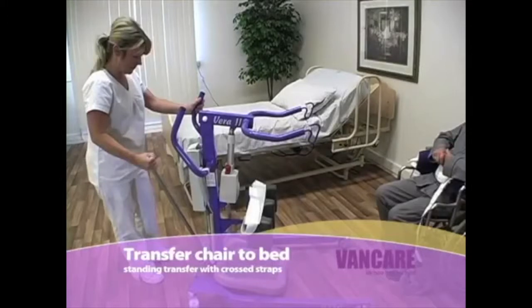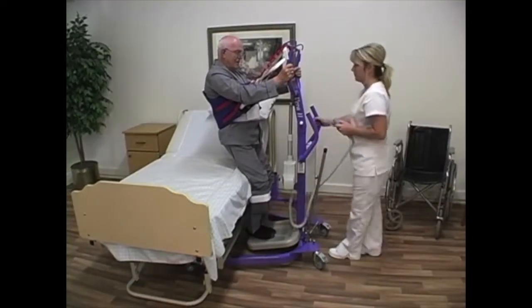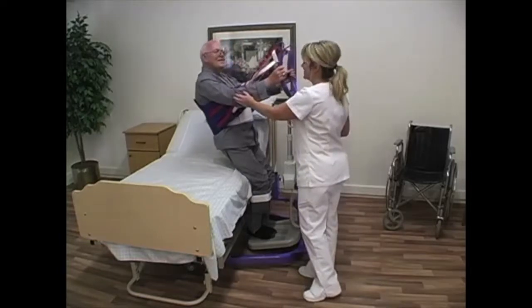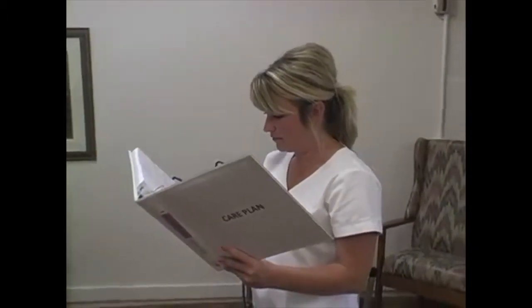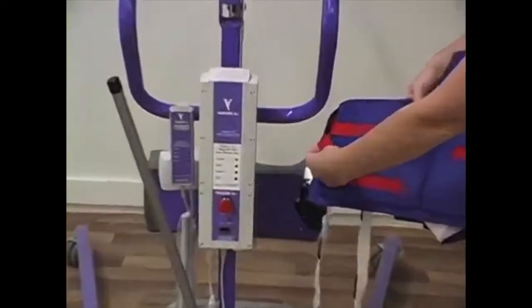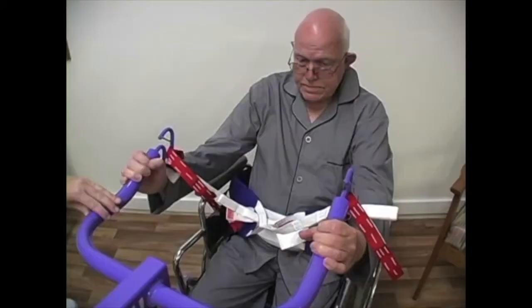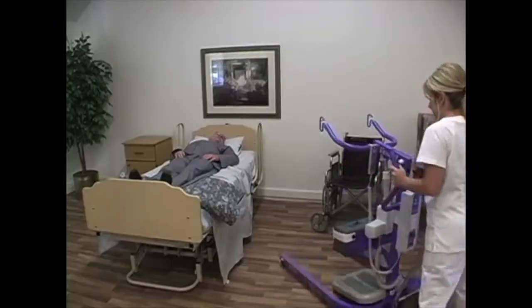Transfer from chair to bed — standing transfer with crossed straps. Before transferring a client, be sure to perform all pre-transfer procedures, which include checking the care plan to find out how many staff members are required, which size back belt and which method of connecting the back belt to the lift arm hooks is to be used, perform lift and sling inspections, and do a pre-transfer trial run.